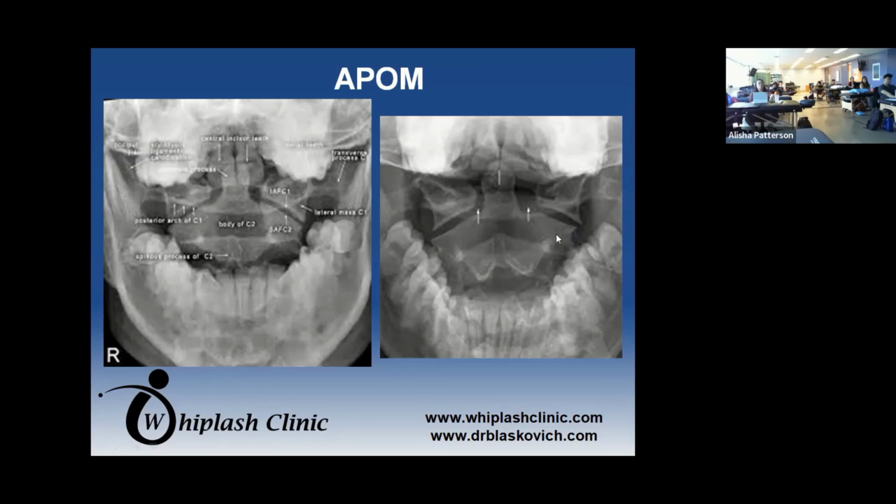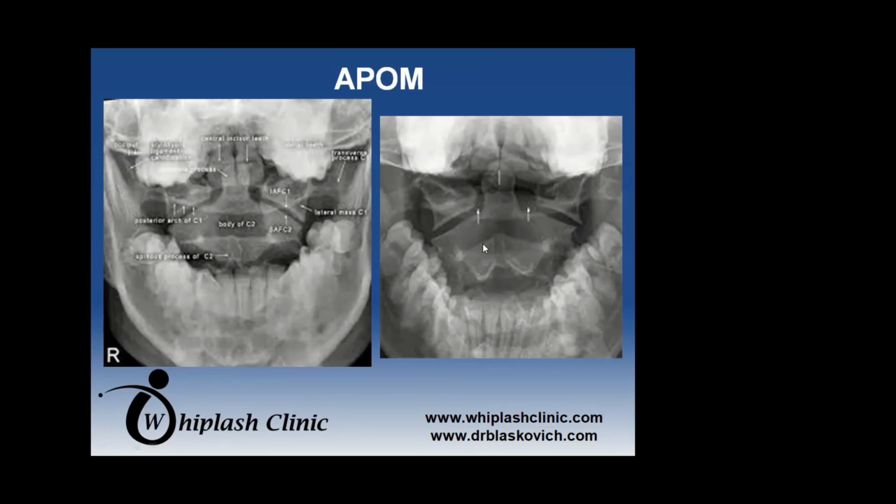Yes. So this is an absolute, in my experience over the last 20 years, an absolute suspicion for upper cervical ligament damage, which would then predicate this person being strongly qualified to undergo motion X-ray. And I'll show you at the end. Like I said, it's a teaser because this is just supposed to be a conventional X-ray lecture. But at the end, I'll show you a teaser of how a motion X-ray picks up on things that a static X-ray will never be able to do. You can just get little hints and tip-offs that would tell you there's probably something wrong. But with the motion X-ray, you can actually see it happen in real time.